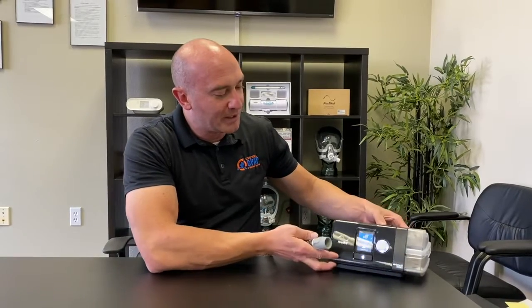This is Mark from LiveWell CPAP and Medical Supply, and today I'm going to go over the ResMed AirSense 10 Auto CPAP. We'll start out with the cleaning, and then we'll go into the functionality of the machine.